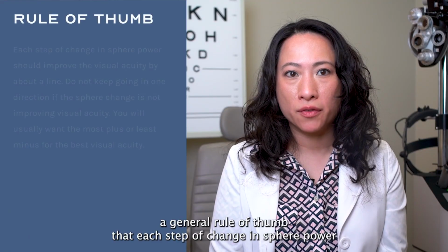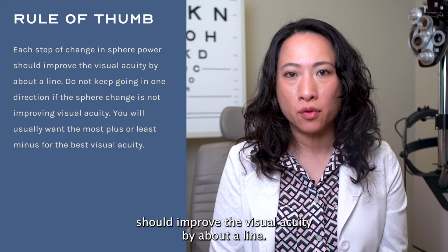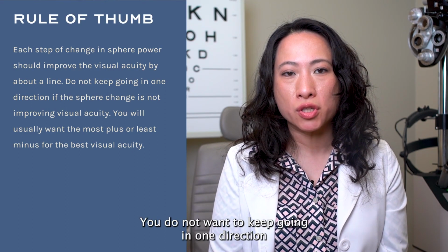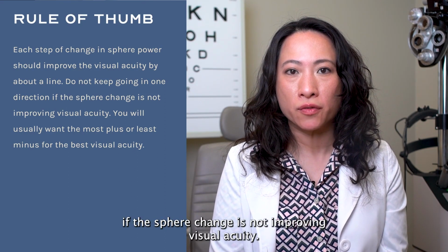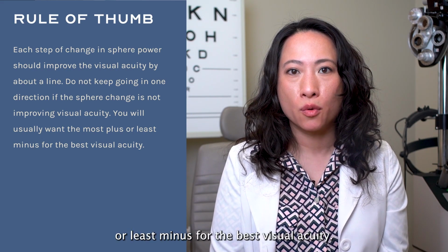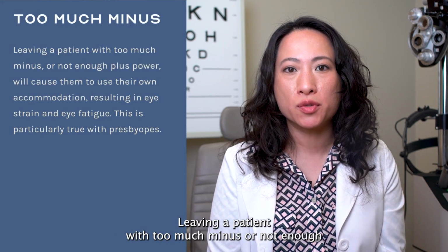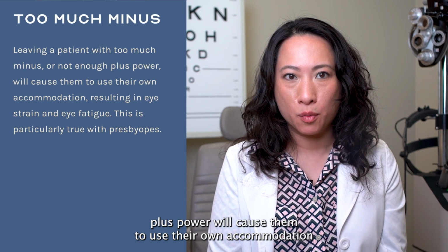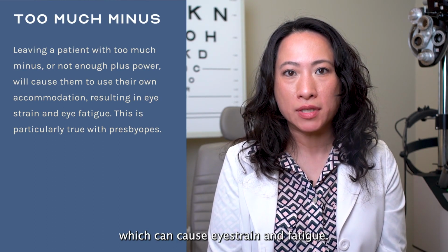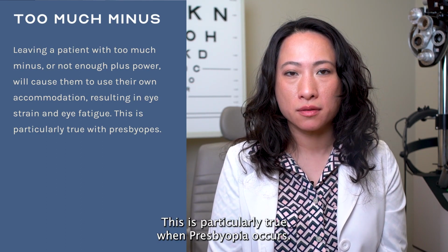It is a general rule of thumb that each step of change in sphere power should improve the visual acuity by about a line. You do not want to keep going in one direction if the sphere change is not improving visual acuity. You will usually want the most plus or least minus for the best visual acuity. Leaving a patient with too much minus or not enough plus power will cause them to use their own accommodation, which can cause eye strain and fatigue. This is particularly true when presbyopia occurs.